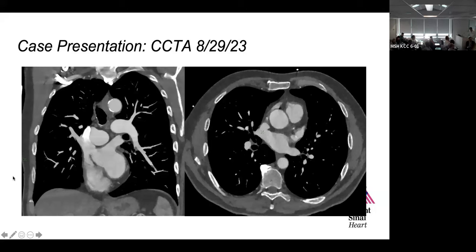Okay, great. Question over here. Do you recommend any venous phase imaging when you're doing arterial phase imaging for the congenital cases generally as a technical aspect or not really? Like, let's say this patient did not have an MRI before at centers and the patient just had an echocardiogram and then was sent for a CT. Do you add venous phases in them usually to define the anatomy better or not really?